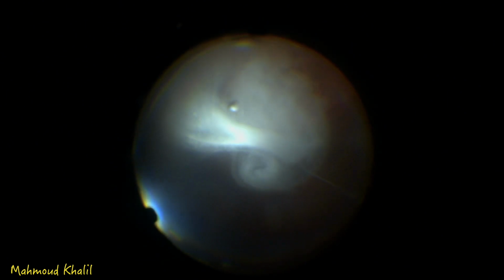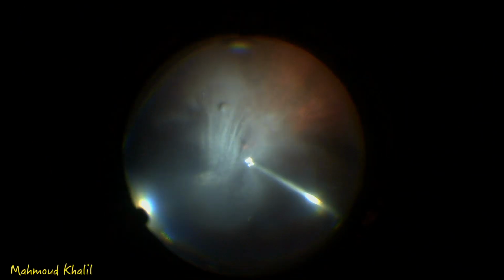After total removal of the vitreous hemorrhage, we restain with triamcinolone. Restaining helps to identify if there is a remnant layer of posterior hyaloid, what is called vitreoschisis, which is commonly present in diabetics. After removal of the precipitates of triamcinolone, we are sure there is no additional layer.